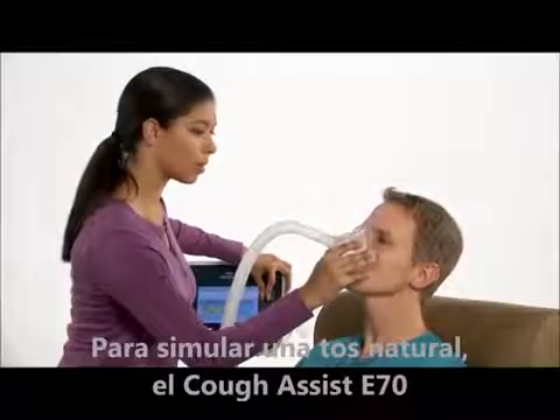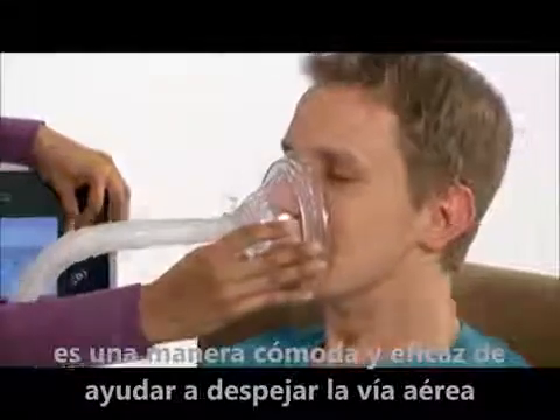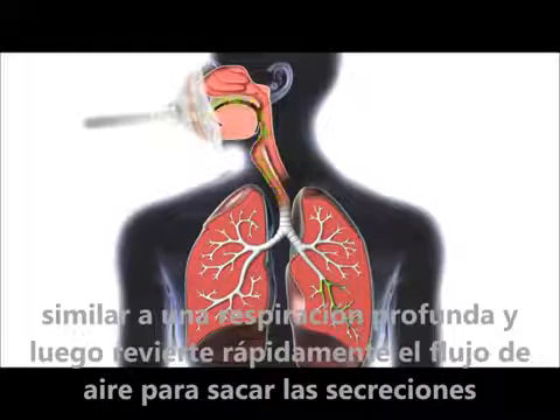By simulating a natural cough, CoughAssist E70 is an effective, comfortable way to help clear the airway. It gradually delivers a large volume of air to the lungs, similar to a deep breath, then quickly reverses the airflow to pull secretions out.